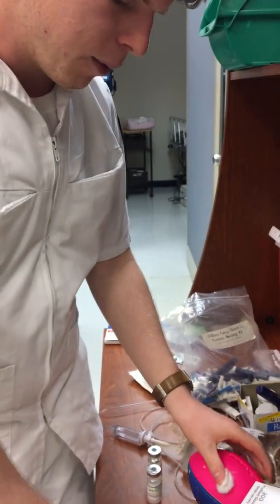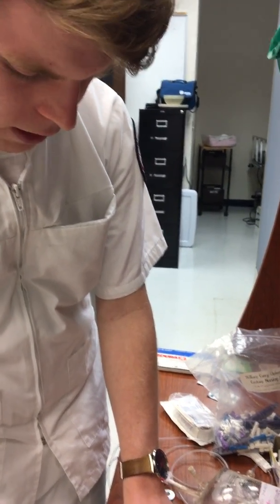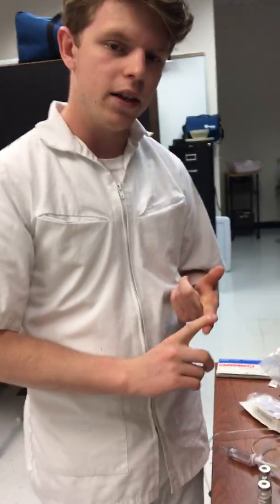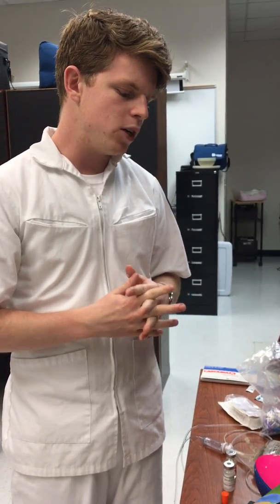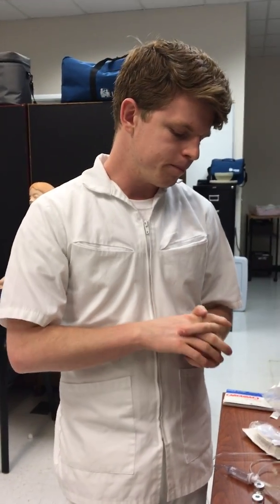Once we do that, then I would safely dispose of my insulin needle into the sharps container. I would document the site. I would document where I did it, what the time was, the type of insulin, how the patient tolerated it, and make sure that I do thorough documentation. And then I would come back in a few minutes and just assess the patient to make sure that there are no signs of hypoglycemia. And so that's how you do insulin administration.